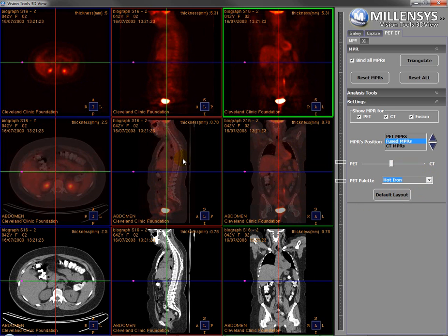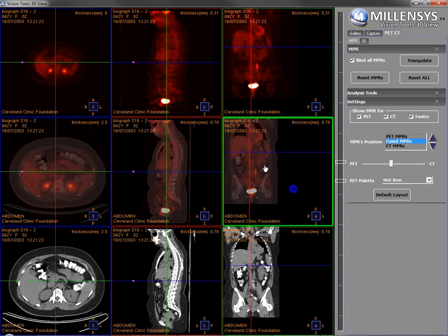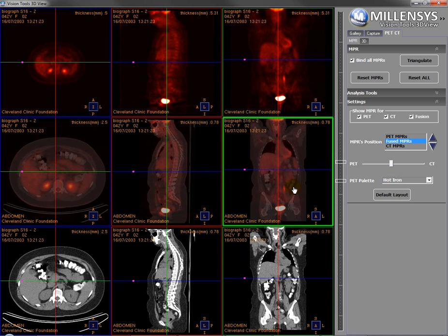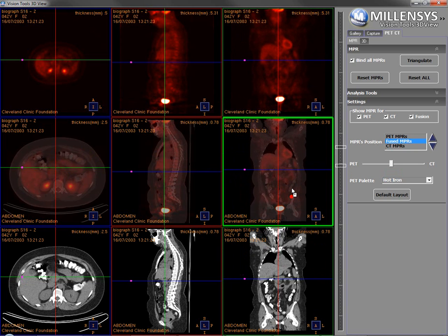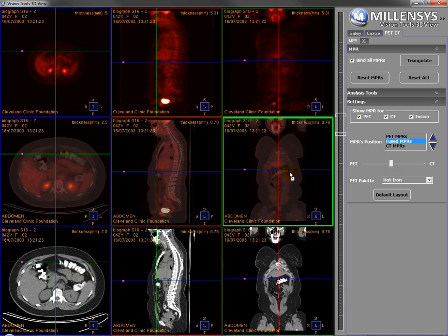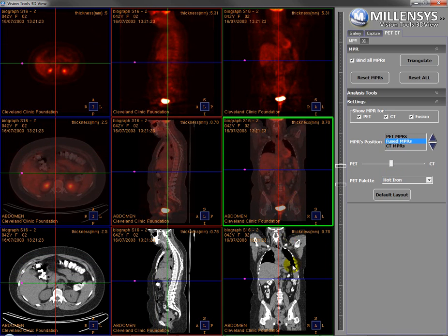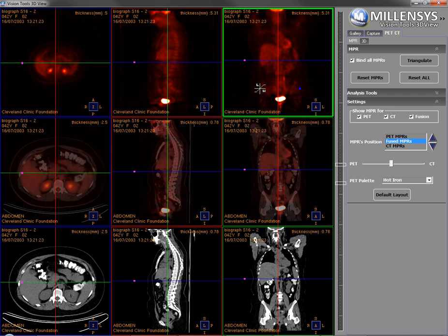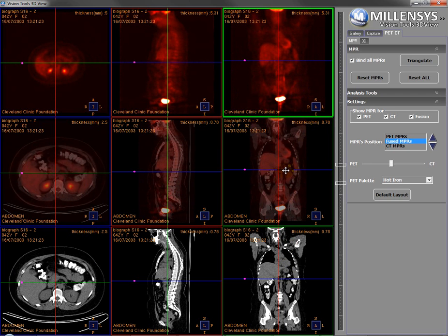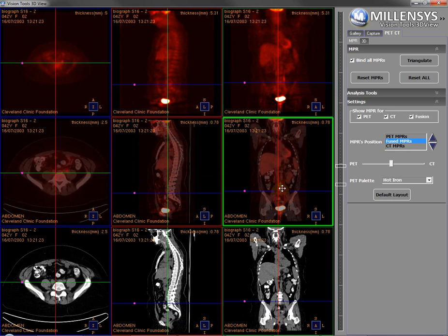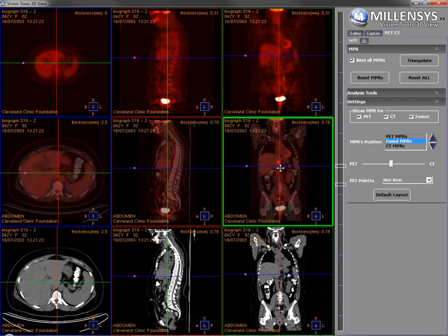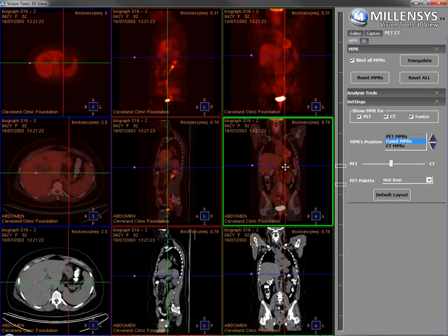Let's discuss the tools available on the MPR. I can pan any view by pressing the left and the right mouse button together. With the left click, I can go through the images in a cine-like mode. With the right click, I can change the window level of the CT or of the PET. I can move any of the MPR axes to change the view, and I can move both of them if I click on the middle point with the left click.